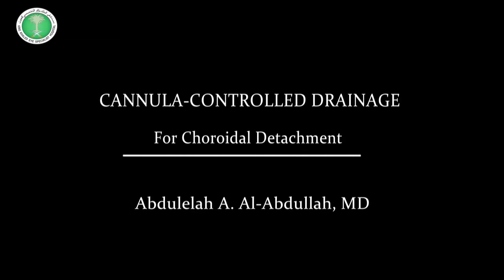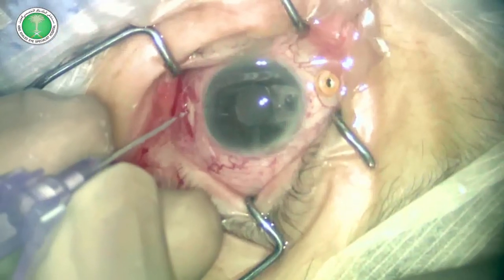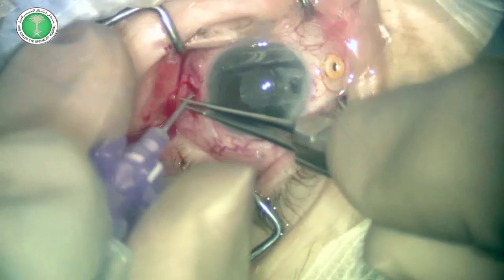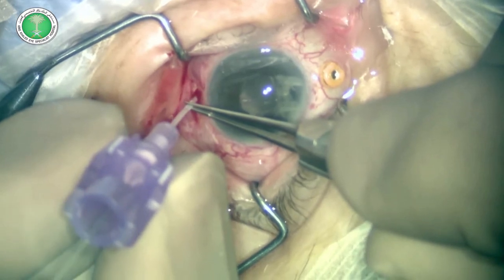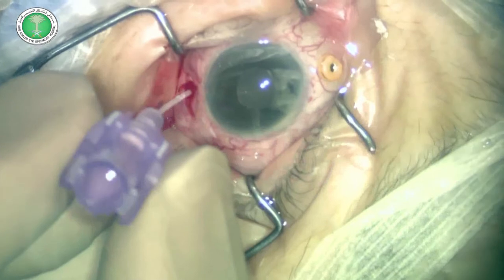The same technique can be used in choroidal detachment drainage. We choose the site of maximum choroidal elevation. We puncture the scleral location with a 26-gauge IV cannula. Once the needle is drawn out, choroidal fluid can be seen at the hub of the cannula.